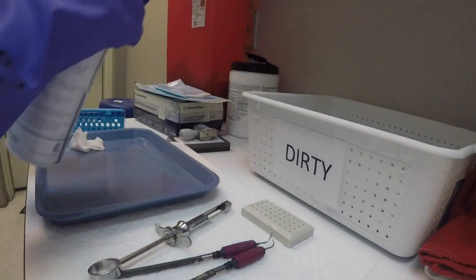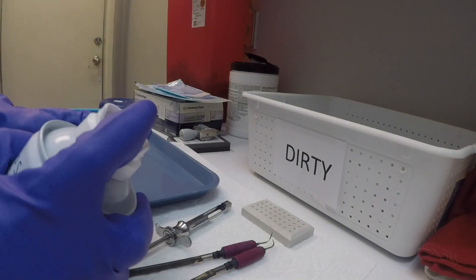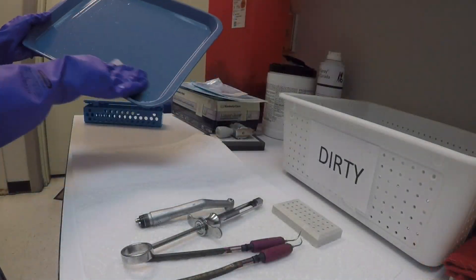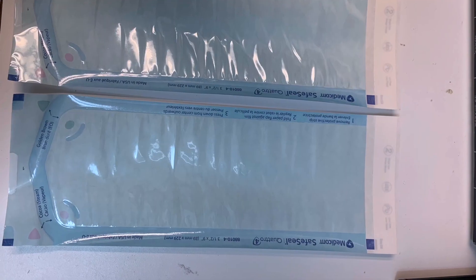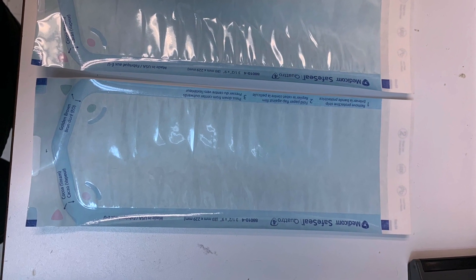Wipe those instruments with the Cavi-Wipes. Do not forget to lubricate your handpiece too. Then wipe the tray and put it away. While we are still waiting on our ultrasonic cleaner, let's prepare our sterilization packs.